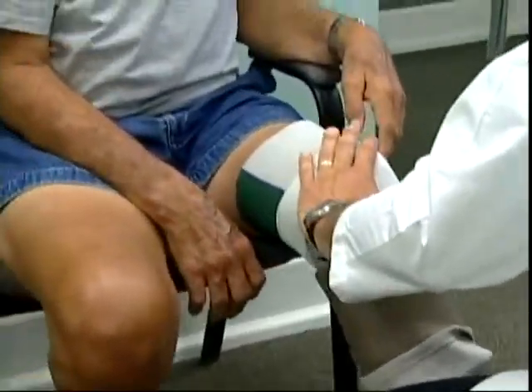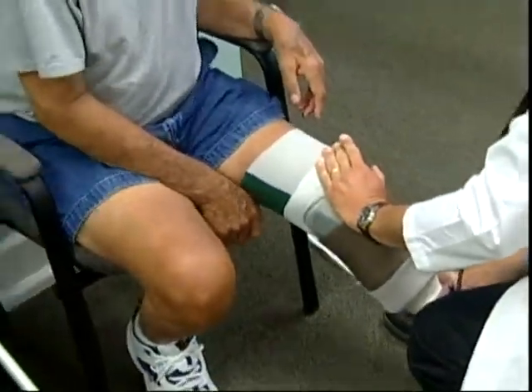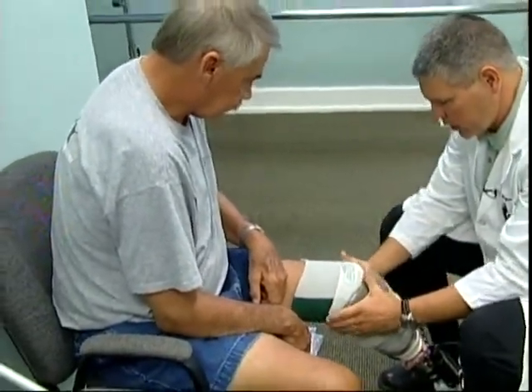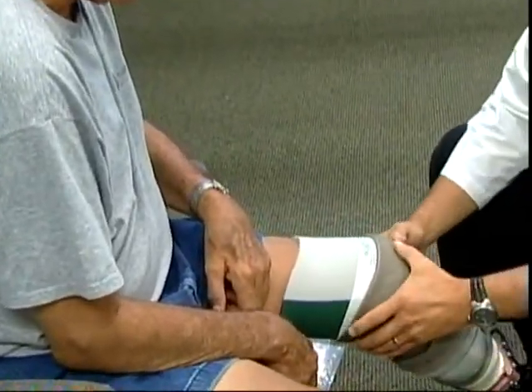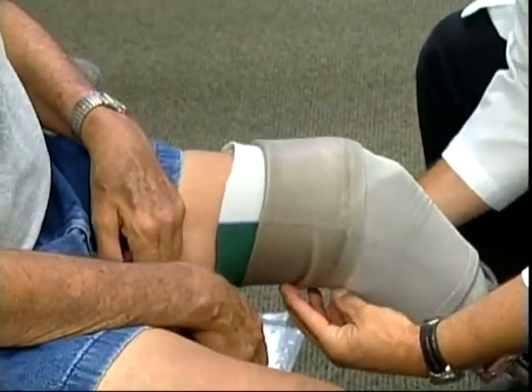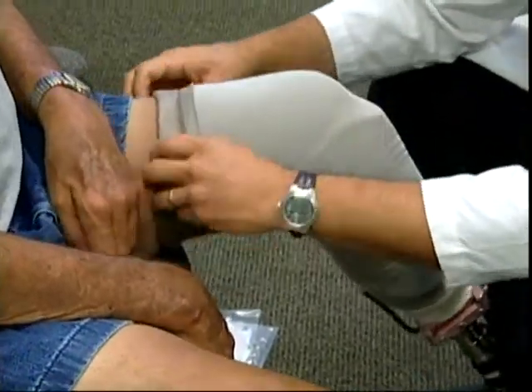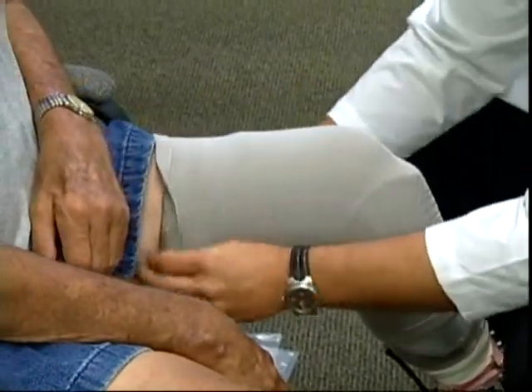Then we're going to push down into the device. Try to get yourself seated as firmly as you can into the bottom. That's it, just like you would with your pin system. Then we roll the sealing sleeve up over the knee. That's super tight. It's not super tight, it's snug. And it's going to help create that vacuum as well. That's correct. What it does, it seals on the upper thigh here. And by creating the seal, we create the vacuum.